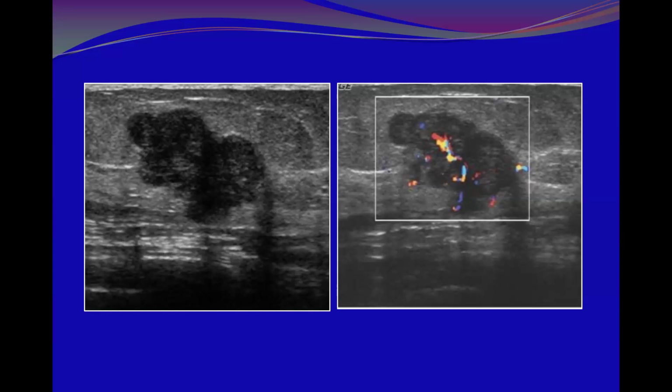The margins I can see here, yes, anteriorly it is circumscribed. I can see it sharply here and even this. But what about here? The margins here are not sharp, are not clear. There is a cutoff of the tissue plane adjacently.